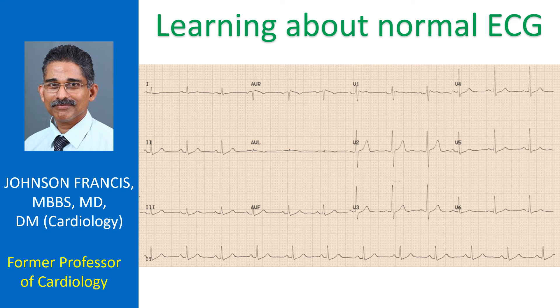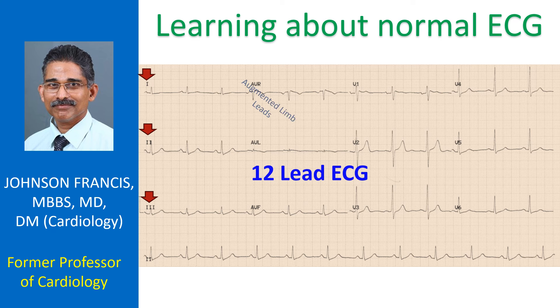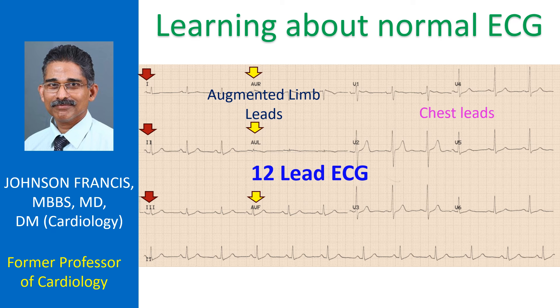Here is a normal 12-lead ECG. A 12-lead ECG consists of 3 standard limb leads — leads 1, 2, and 3 — 3 augmented limb leads: AVR, AVL, and AVF, and 6 chest leads, V1 to V6.